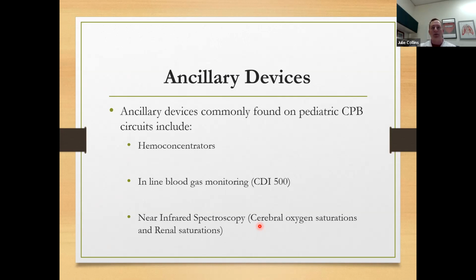The Somanetics pads used to, with darker skinned babies, not read correctly, whereas the Foresight we use is more sensitive to darker skin. And I think Somanetics has fixed that problem. I remember back in the day, we'd always have issues with that. But when the baby comes in, especially newborns, their heads are greasy, okay? You stick a pad right on, and it's not uncommon for that pad to come off a little bit, or to be compromised.